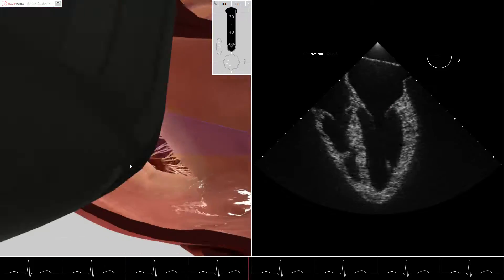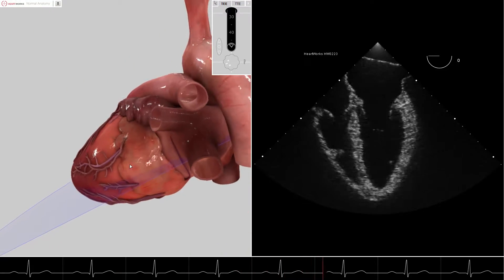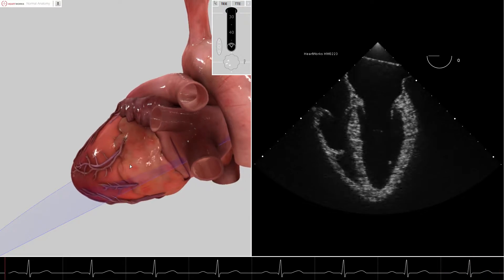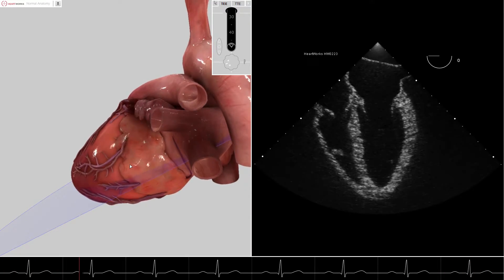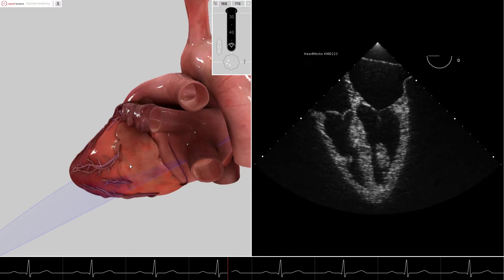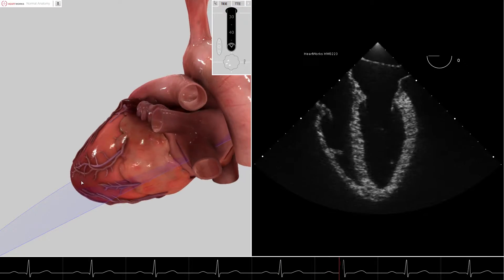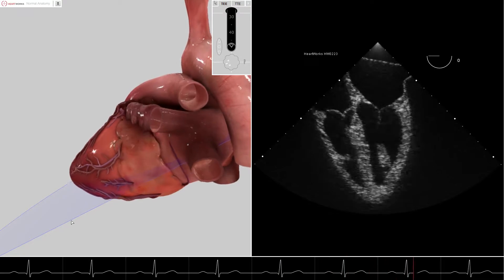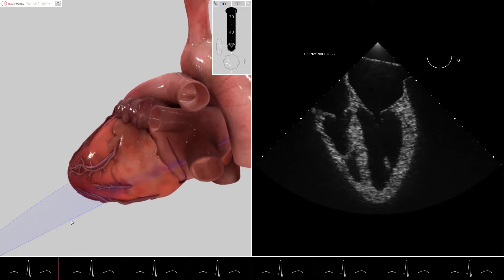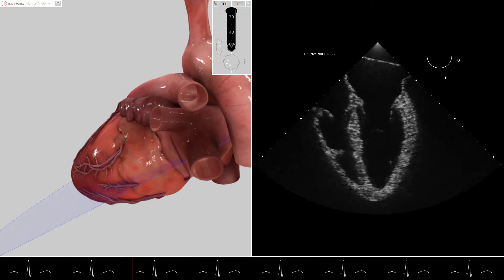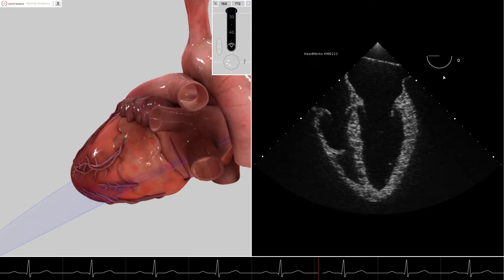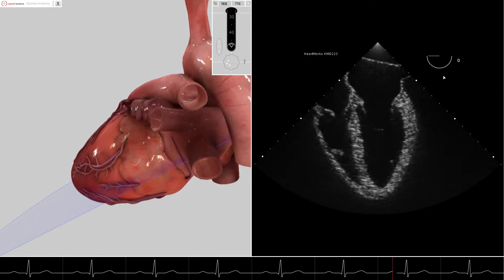In order to orient ourselves to the ultrasound image, we will temporarily zoom out of the virtual reality image to establish our bearing. First, we see that at zero degrees omniplane, the left edge of the cut plane in the virtual reality image on the left screen corresponds to the marker of the true ultrasound image on the right screen. It is paramount to remember that this will always be true, regardless of the angle of the omniplane.